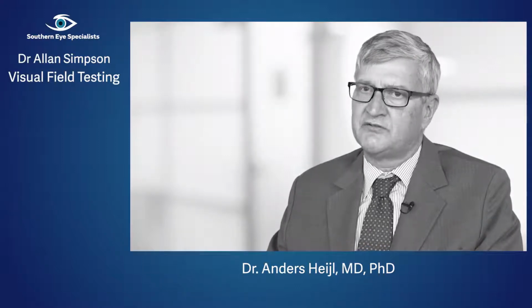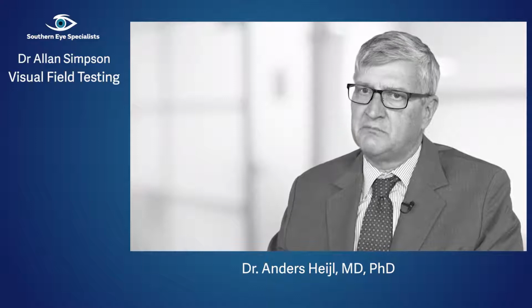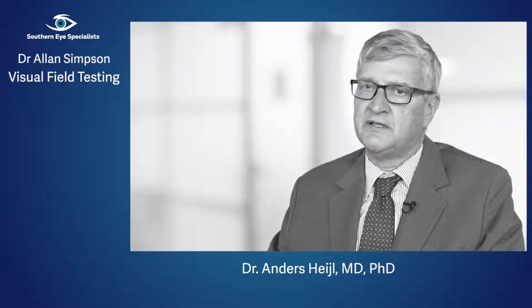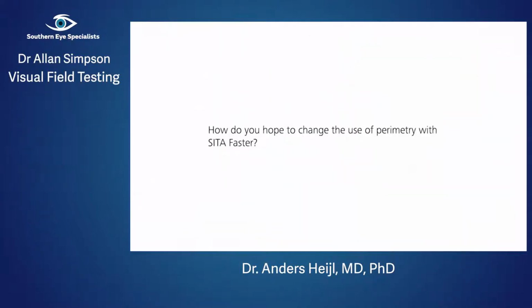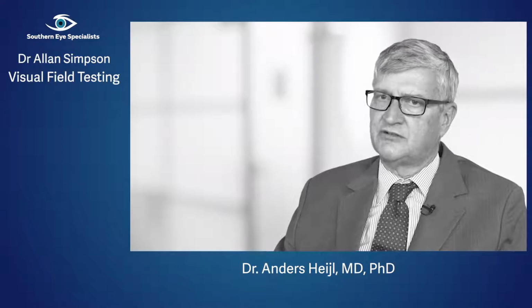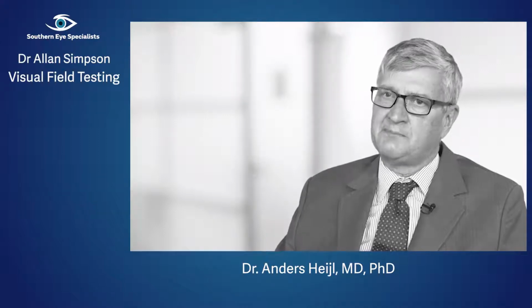So as a result of the trials, new clinical recommendations came out, for instance, in the European Glaucoma Guidelines, recommending that we should obtain more visual fields, particularly in the first few years after diagnosis. The European recommendation is 3 fields per year for the first 2 years after diagnosis, which is much more than we used to do in the past, and therefore the need for faster tests increased. Large changes don't take place overnight, but my hope and our goal with creating SITA Faster is to increase the frequency of field testing so that clinical reality comes closer to the practice recommendations. And if that happens, I will be happy.